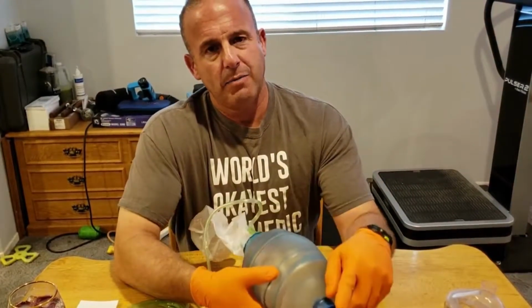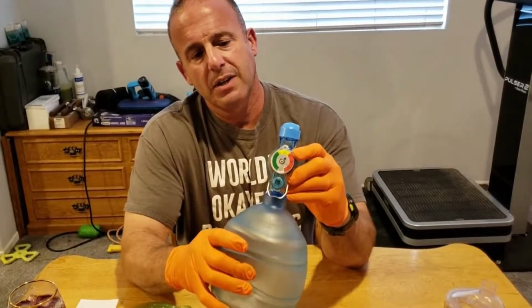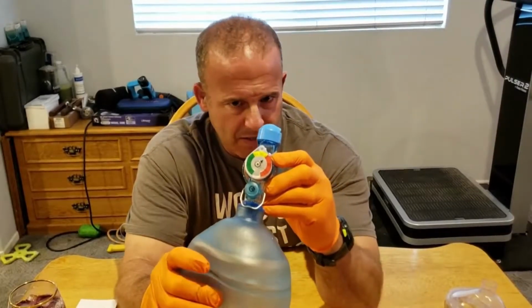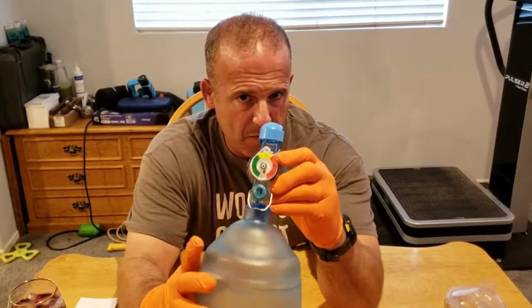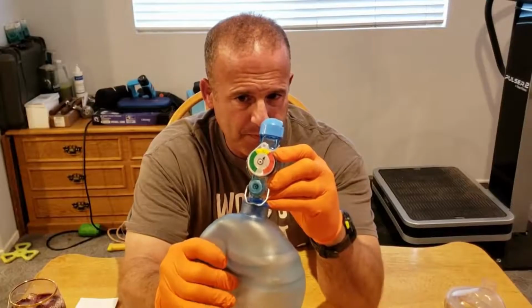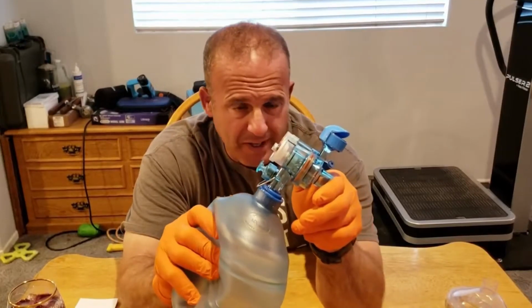If I plug the outlet right here, I'm going to take my thumb and plug it and just squeeze, you'll notice that the bag releases, or the manometer shows a release at about 40 centimeters of water. This is a kind of leftover from the old days.